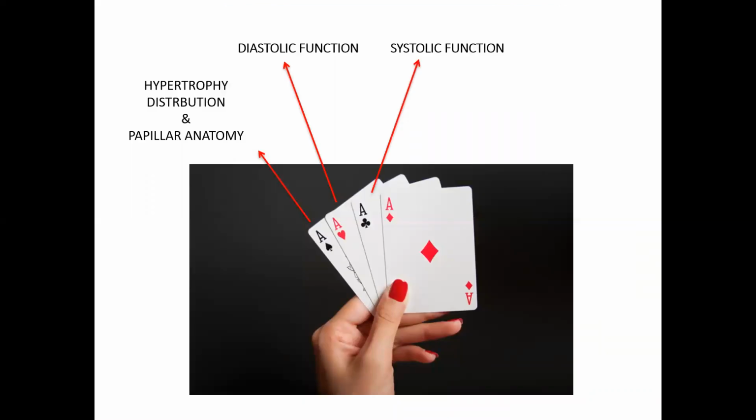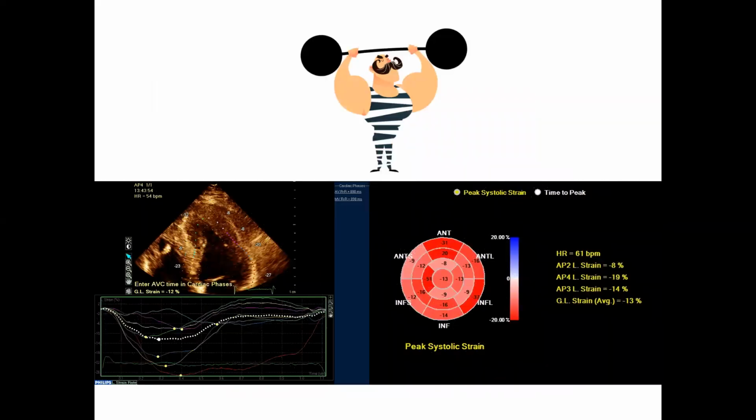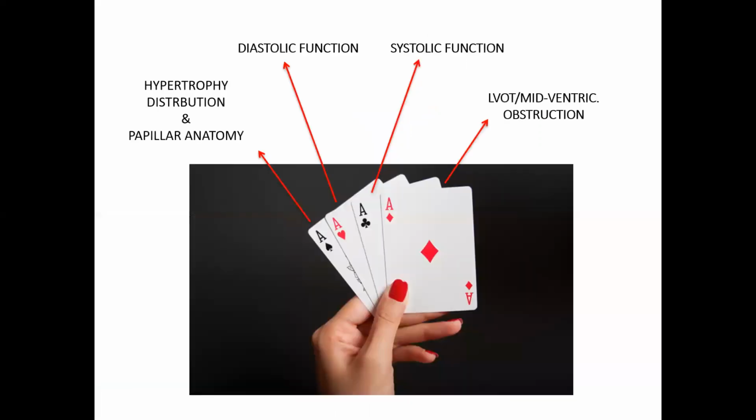The architectural disarray generated in hypertrophic cardiopathy also involves a systolic alteration. Ejection fraction is supernormal until the terminal phases of the natural history. In case of hypertrophic cardiomyopathy, the cutoff of normality for EF is 70%. More accurate systolic analysis can show a pathological pattern of longitudinal strain with characteristic pathological values in the ventricular apex and mid-septal wall.